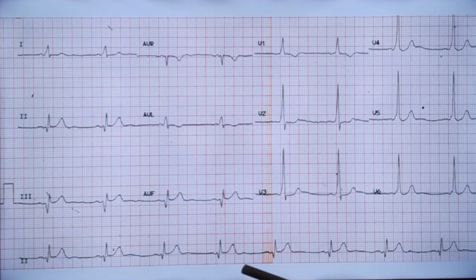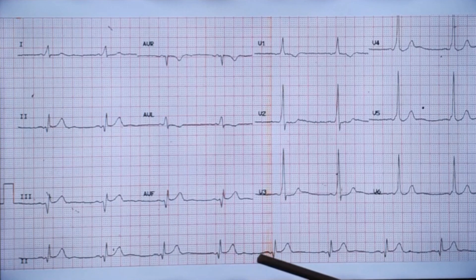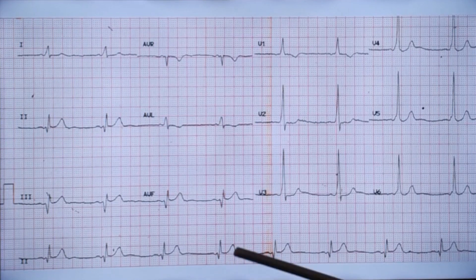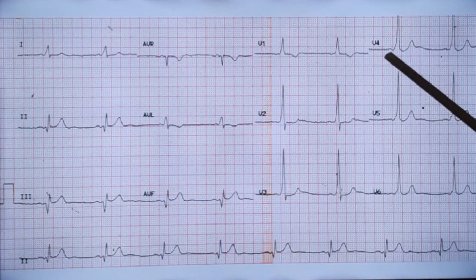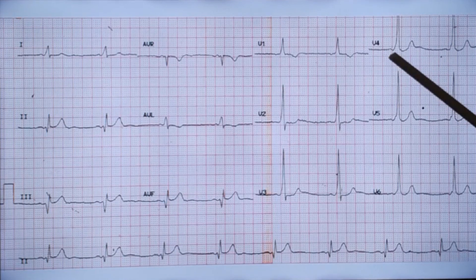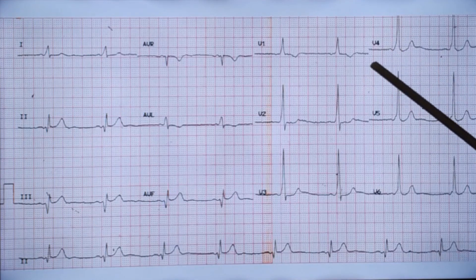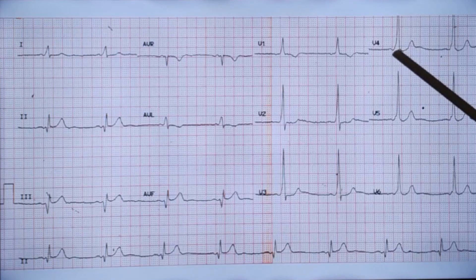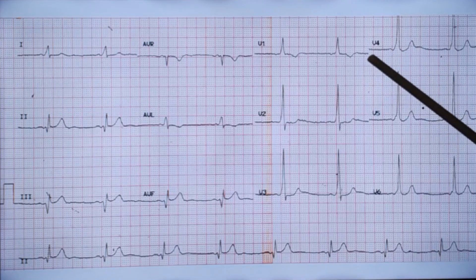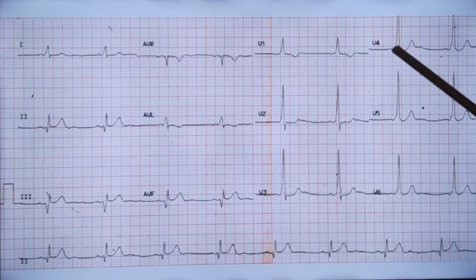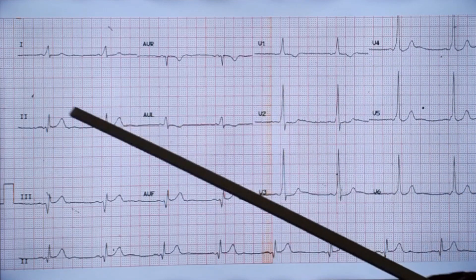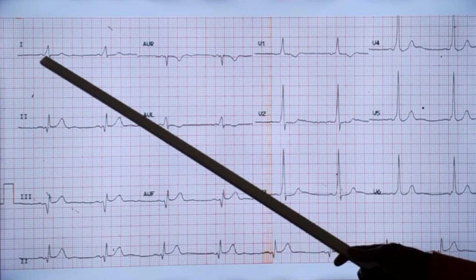This ECG shows sinus bradycardia with a rate of around 50 per minute. In addition, you can note that the PR interval is short — a short PR interval followed by a delta wave. This region is called the delta wave due to pre-excitation. The shape of this region resembles the Greek letter delta as well as a river delta, which is why it is called the delta wave. You can see the delta waves in all leads along with the short PR interval.